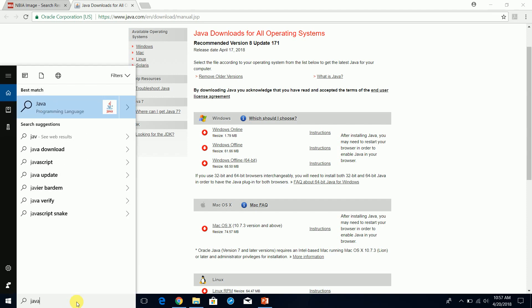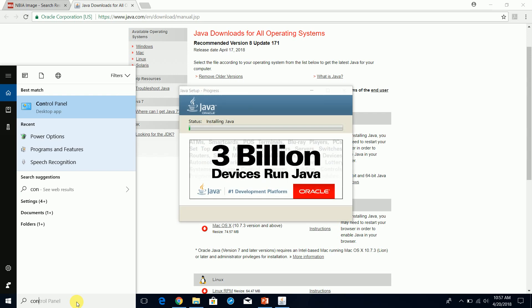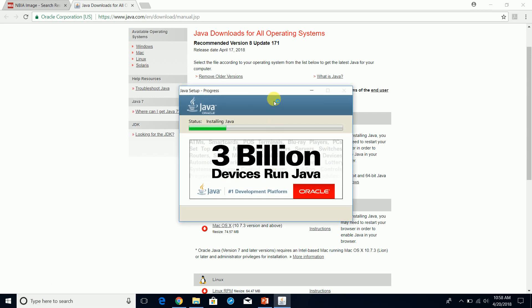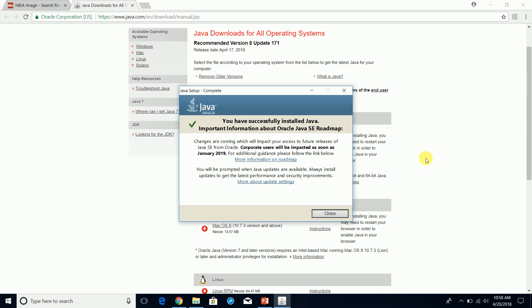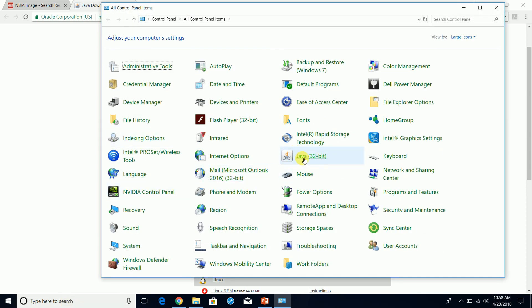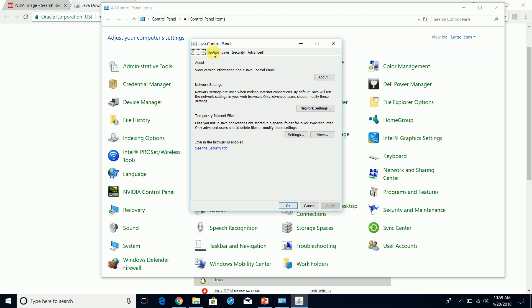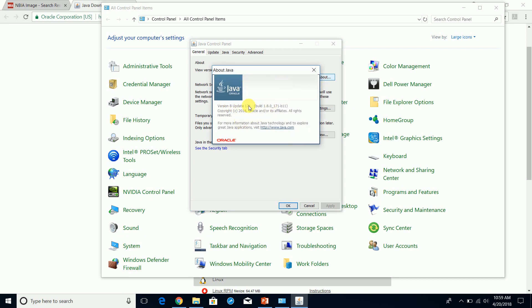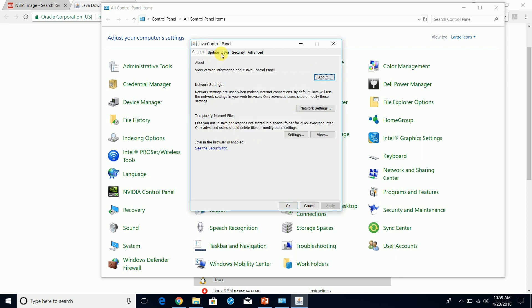I paused the video while the install completed. You can tell when Java is installed by going to Control Panel, where you'll have your Java control panel. Click on that, go to About, and it will tell you what version of Java you have installed. We need Java installed in order to be able to download the actual DICOM images.